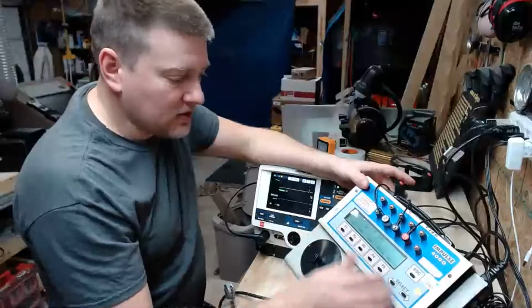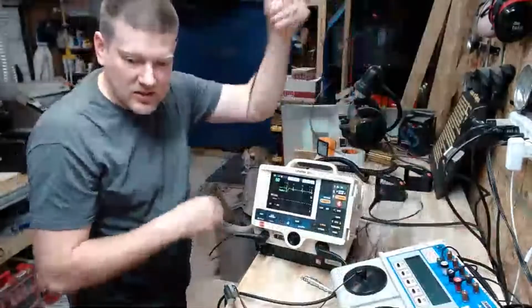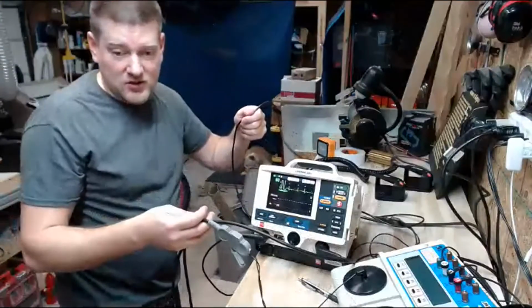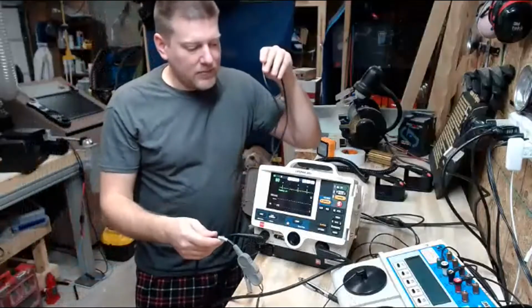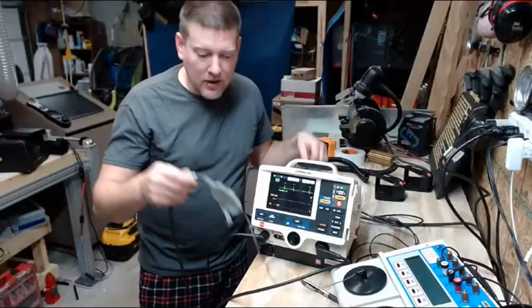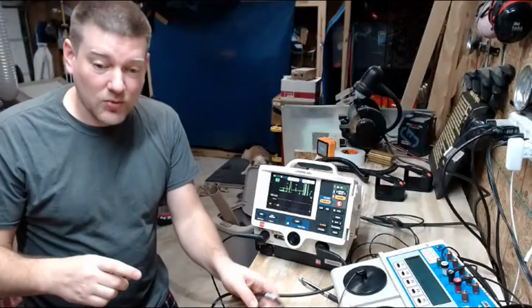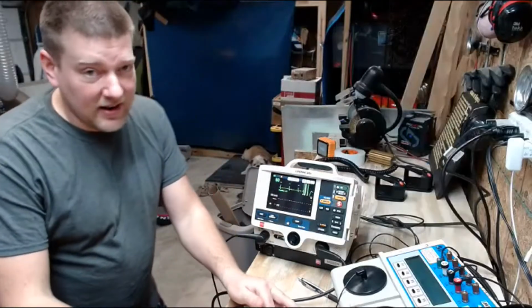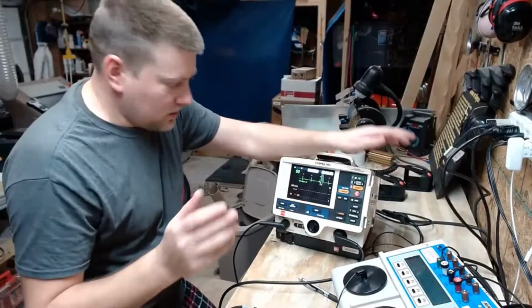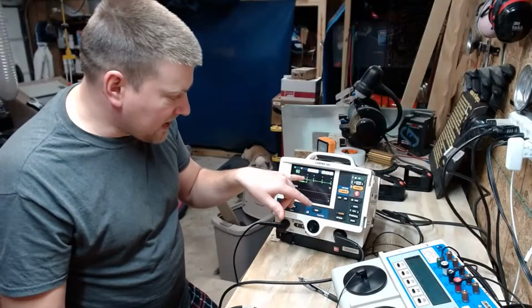Cardio is going to measure the timing between your ECG leads when it senses the pulse and on your other cable when it discharges the pulse. Okay, so that's what you're measuring. It's going to place that little triangle at the top when it senses the peak on this cable, and on this cable here it's going to discharge within 60 milliseconds, which is not a lot of time, guys. That's a real short duration.